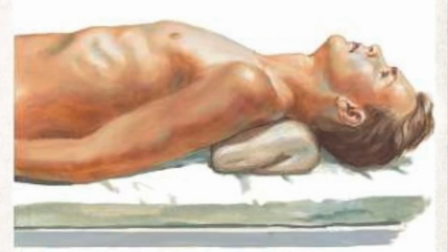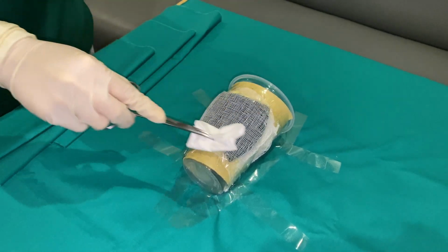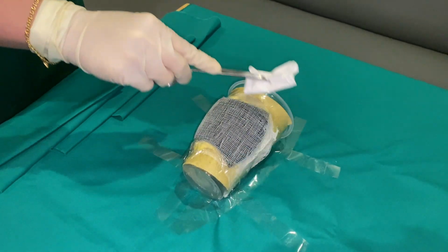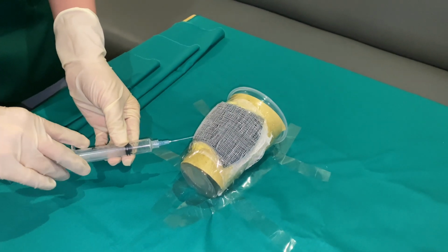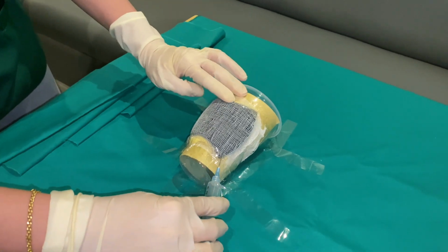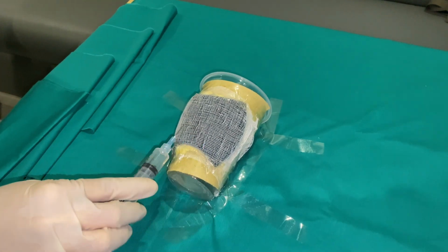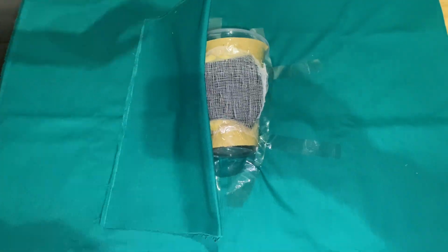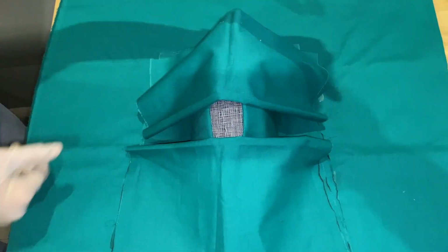Place the patient in a supine position with the neck extended by a pillow or a bag placed under the shoulders. This is done to give adequate access to the cervical trachea. To begin, sterilize the skin in the anterior neck and the chest. A local anesthesia is then administered. Drape the neck. If the tracheostomy is done under local anesthesia, the face can be uncovered.